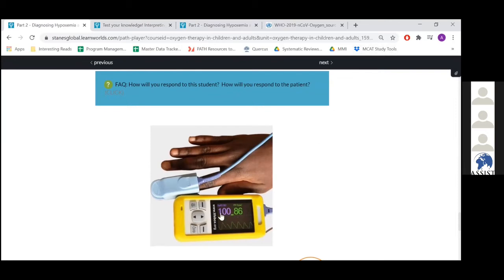So you saw the previous small video. Okay, I see. Raban is putting the heart rate is 55, SpO2 83. Anyone disagree? Okay, Jordan is saying, oh, the patient is bradycardic. Anyone has a different view?